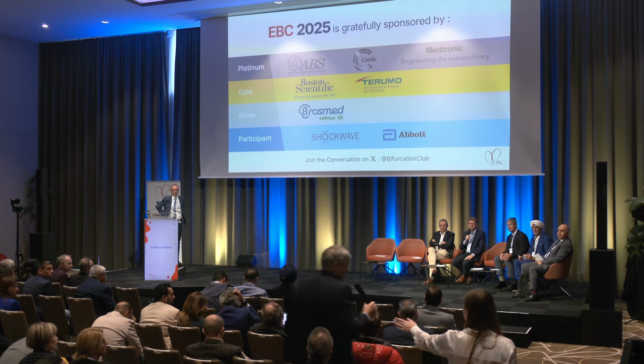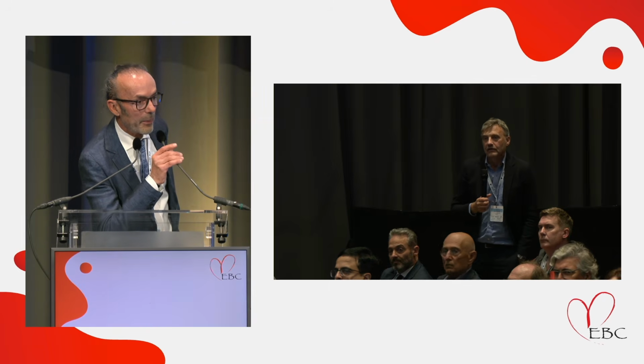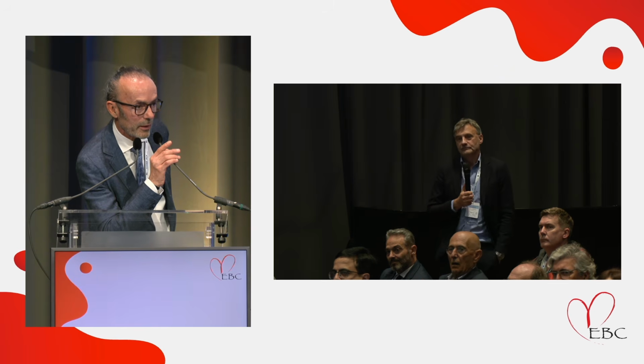Yeah, one more comment from the audience. I had a perforation after maybe too aggressively dilating a proximal circ in a 001 lesion, and had to place a covered stent there, and used the balloon-assisted T-stenting with the balloon in the LAD and the covered stent in the circ. But there you really don't want to cover the LAD with the covered stent, obviously. So use the balloon-assisted because it was a covered stent. You want to be sure not to protrude anything in the left main.